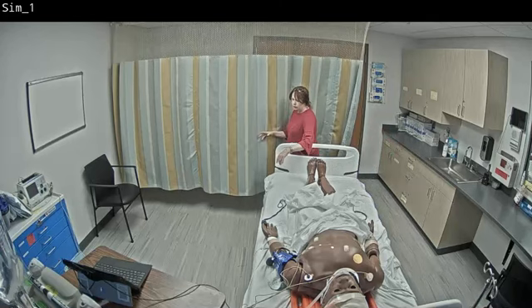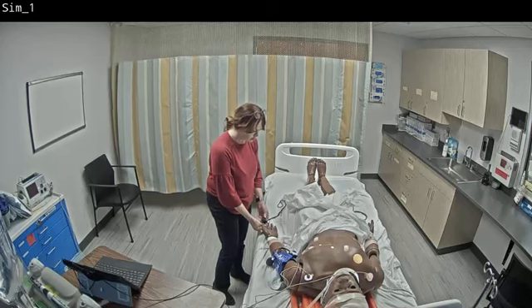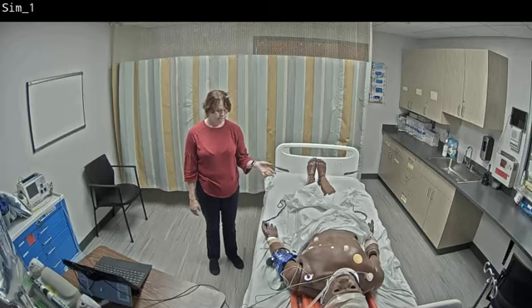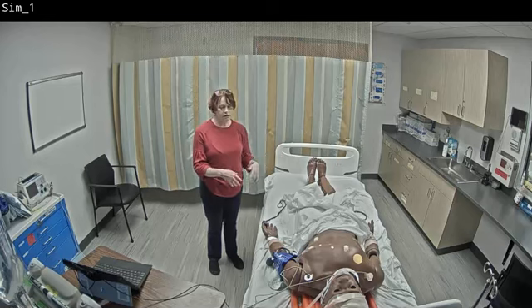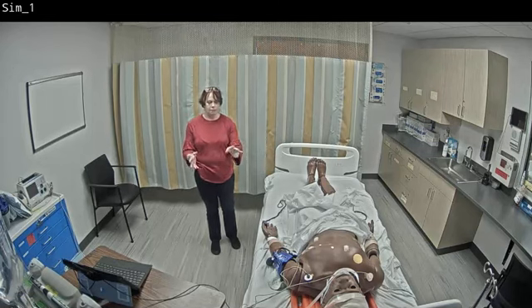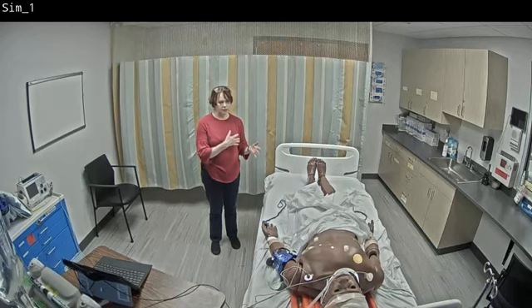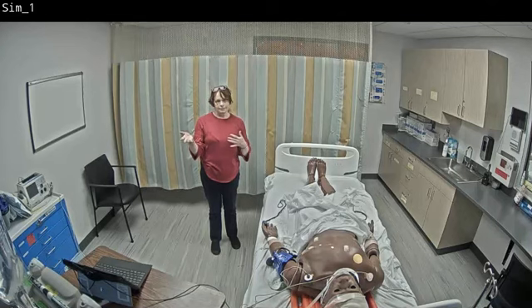This finger over here does have electronic components in it, so if you put this on his finger, you would actually get a SpO2 reading if it's calibrated. But for just the Foley insertion or intermittent insertion, you won't need that. That would be more for simulation purposes, or if your faculty wanted you to do a head-to-toe on the simulator itself. But typically in skills lab, you will be practicing your head-to-toe assessment on either a classmate, a faculty member, or me.